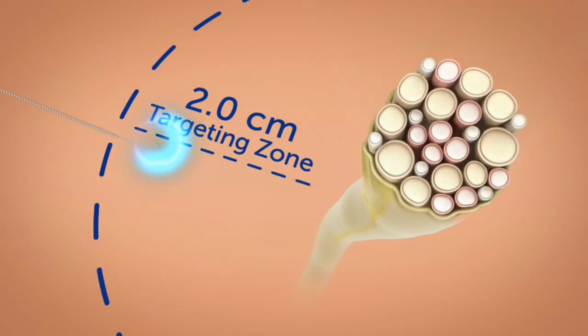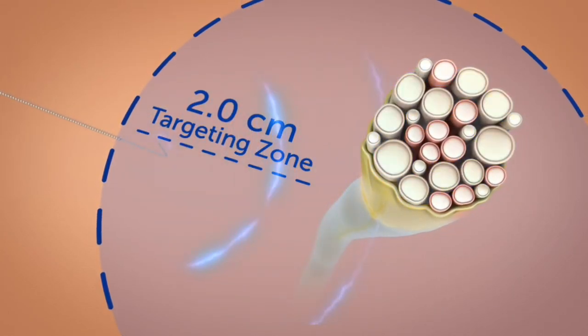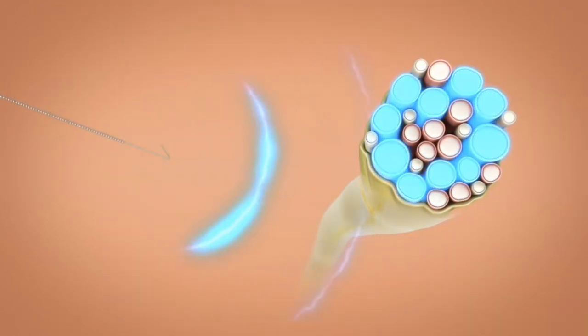When the lead is connected to the pulse generator, narrow stimulation pulses preferentially activate sensory fibers without activating non-targeted pain and motor fibers.